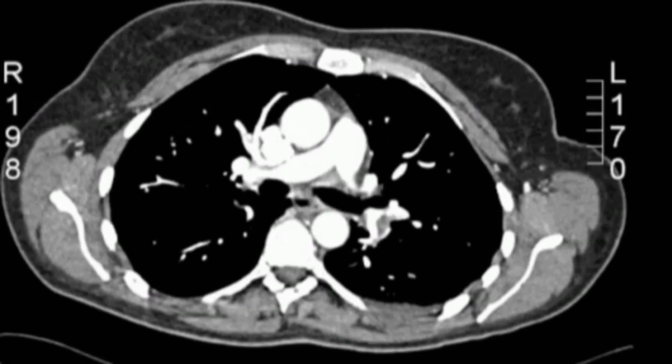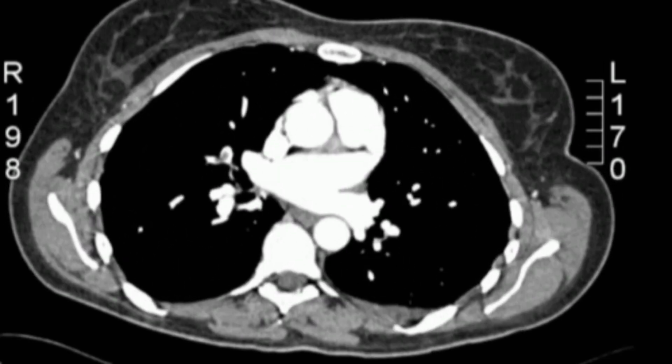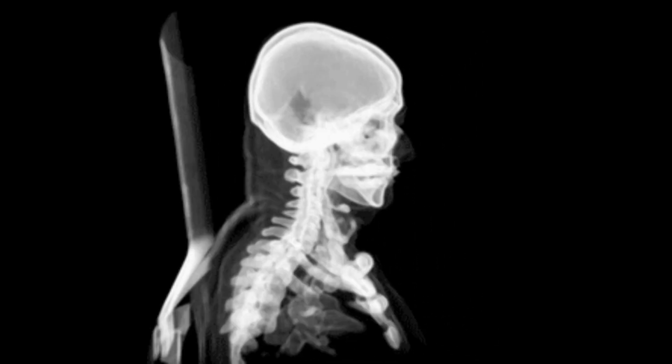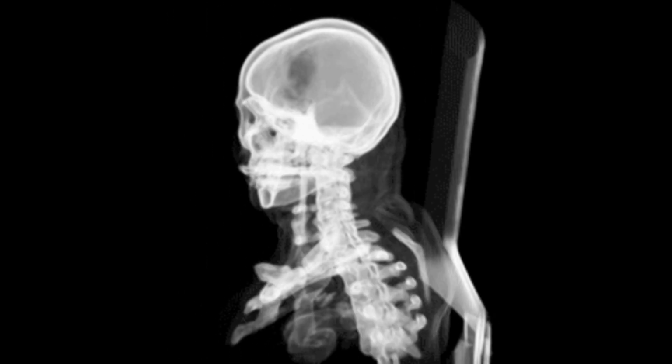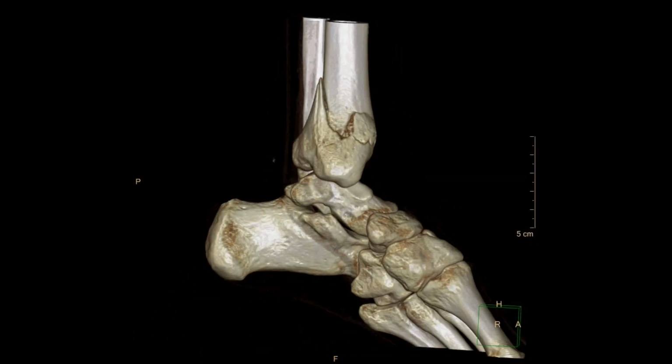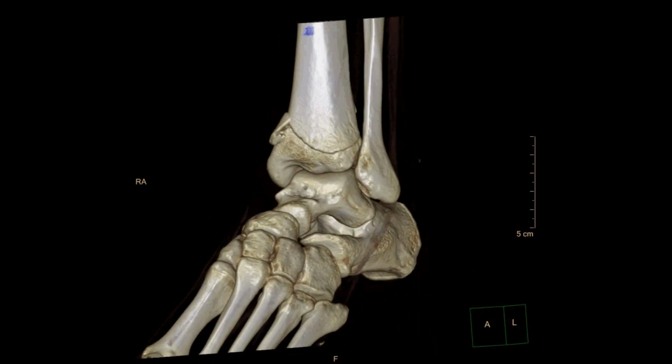The reconstructed images are viewed and interpreted by a radiologist who analyzes the structures and identifies any abnormalities, and the report is given to a doctor for further analysis and decision making. Today's computers can create 3D models using the stacked images so that medical practitioners can get a 3D view of the cross sections. They can rotate the images the way they want so that they can see the image from any angle that they want.